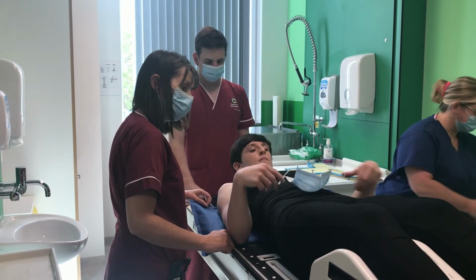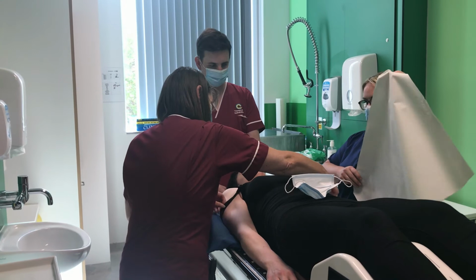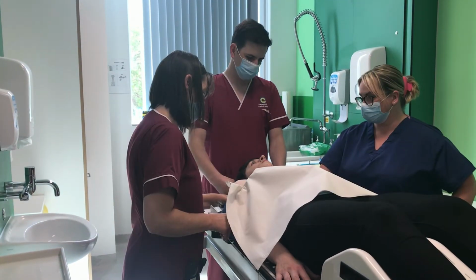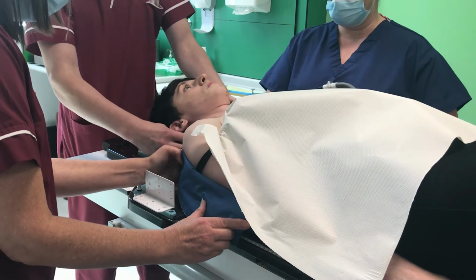You'll be asked to take off your mask, as that will impair the fitting of the mould. The straps of any top will be lowered down to the side of your arms, but you'll be covered over at all times to protect your modesty. A vacuum is attached to the mat you are lying on. This allows it to mould to the shape of your head and neck.